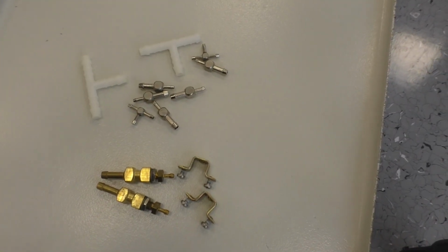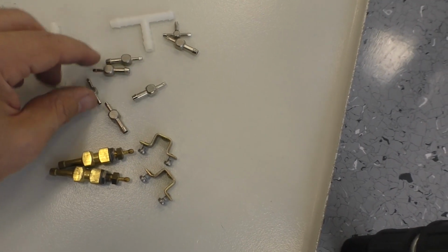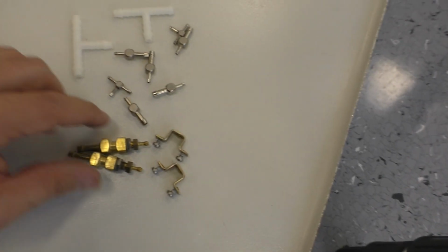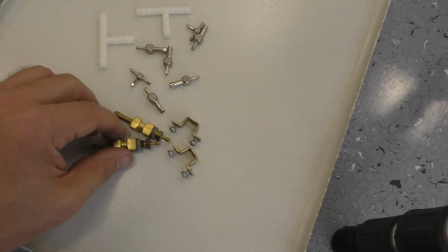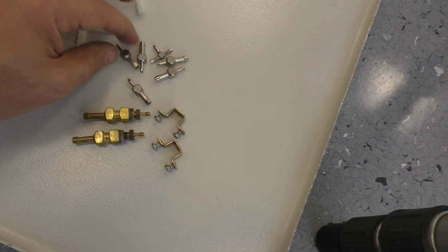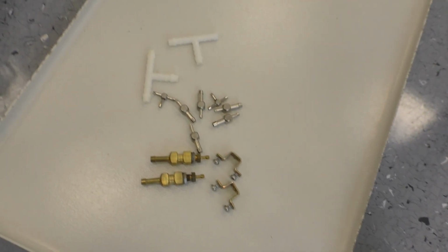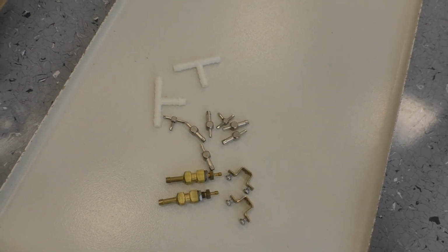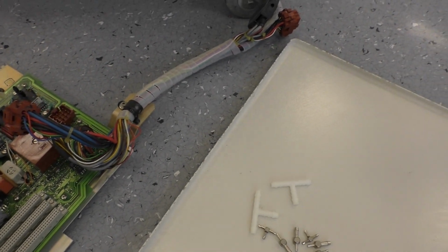Can you see all these parts? Are there any model aircraft or model car makers around? You know what they cost if you have to buy them. A couple of bucks each one of them. And this machine is full of this stuff. Let's go further.